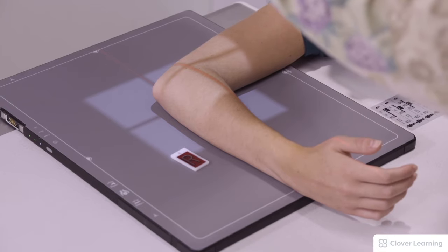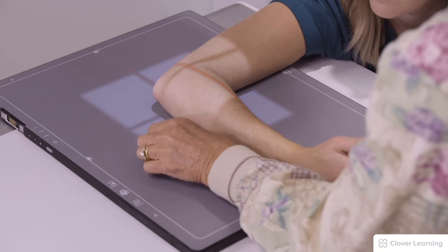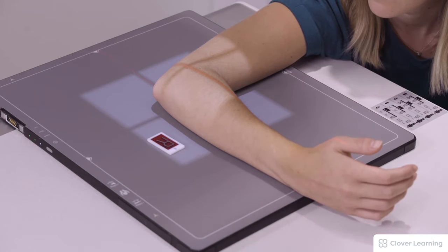We're going to extend that collimation to about 2.5 inches into the radius and ulna. And the exposure is made.